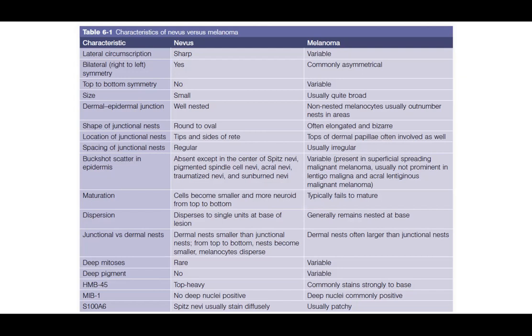However, a recent paper by Dr. Coe and Dr. Billings at the Cleveland Clinic showed that the loss of P16 is much more predictive in the presence of a worrisome Spitz lesion compared to diffuse PRAME positivity. Often you can have diffuse faint PRAME positivity in a proliferating spitzoid neoplasm that's not spitzoid melanoma. But a loss of P16 sets off a more worrisome immunophenotype.